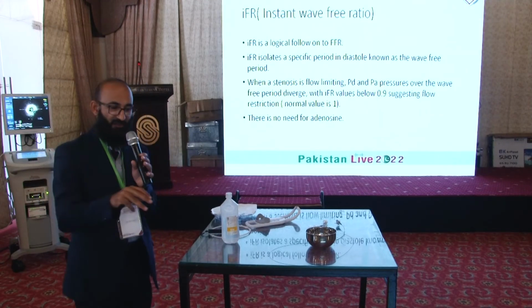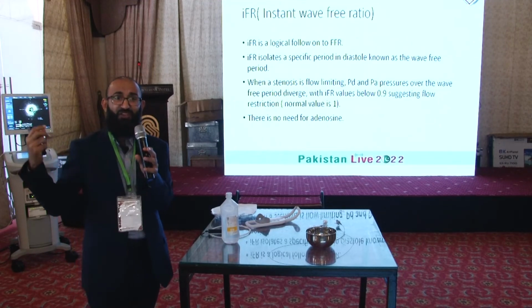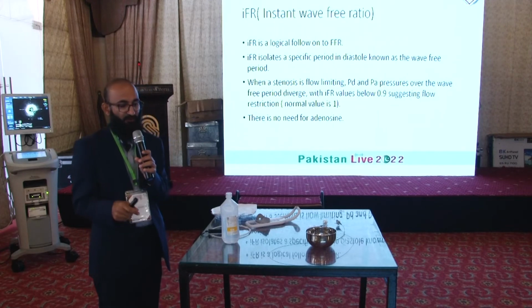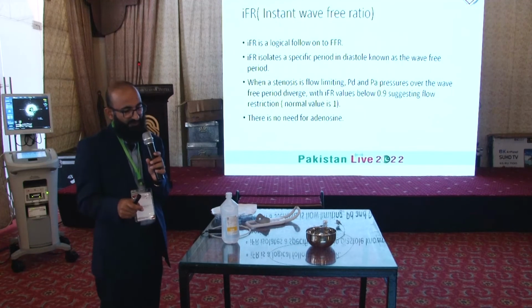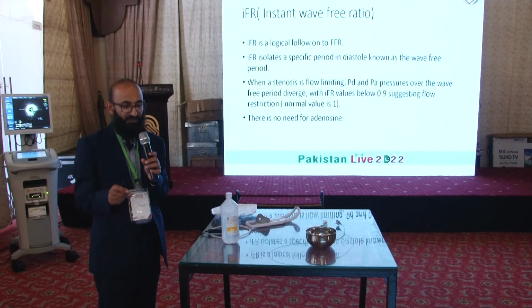You save some time. And another thing is that you don't need to inject adenosine. There is a lot of data on it as well. So iFR is a logical follow-on from FFR. iFR isolates a specific period in diastole known as the wave-free period. When a stenosis is flow limiting, proximal and distal pressure over the wave-free period diverge, with an iFR value below 0.9 suggesting flow restriction.